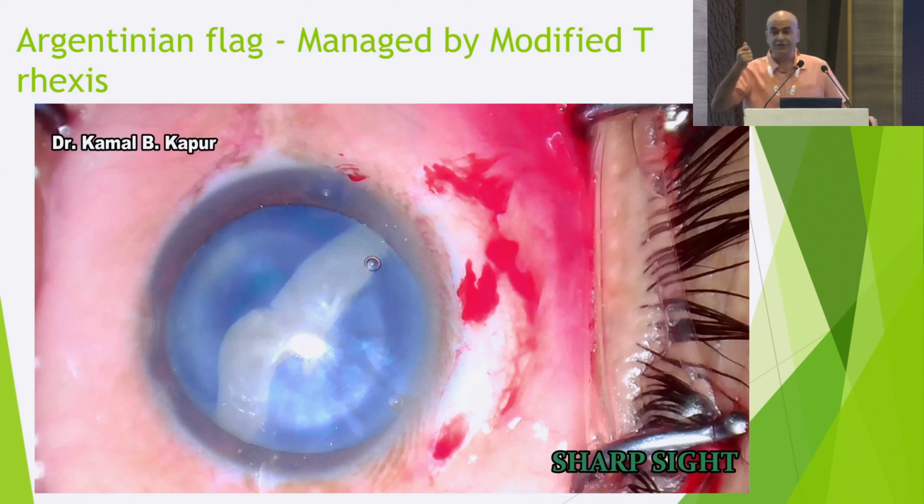If there's a peripheral extension, make sure you relax, don't panic. Do not keep pulling at the tag. Push in viscoelastic, flatten it. Hold the capsule as near to the advancing edge as possible. And with one jerk, bang, 90 degrees to the peripheral extension. One jerk, break it. Do not hesitate. There was so much hesitation there. Pull, push, pull, push. Hold it, boom. So that's what happened.